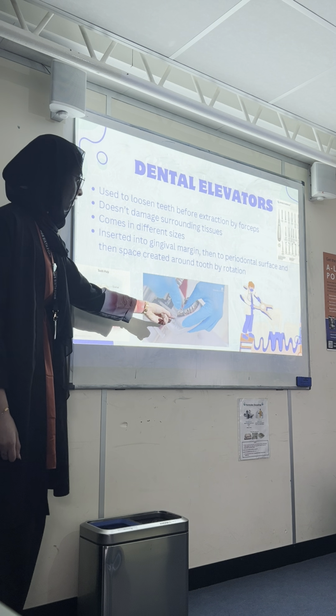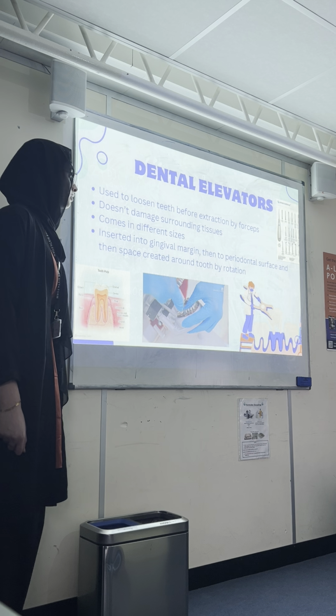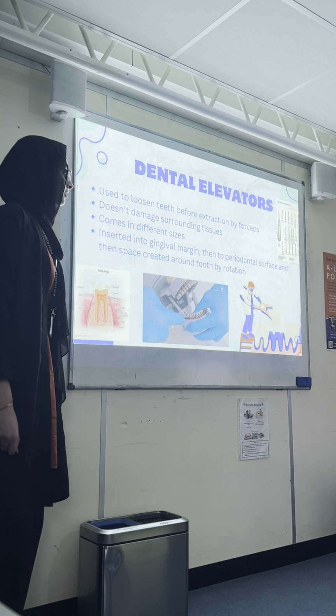So like that, they're driving the elevators into the actual gum so that it loosens the tooth and gets it ready for extraction. Yeah, that's it.